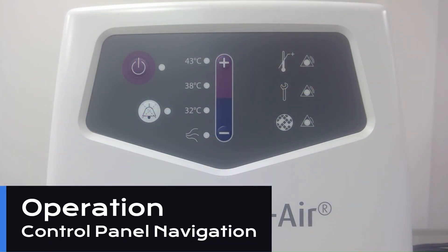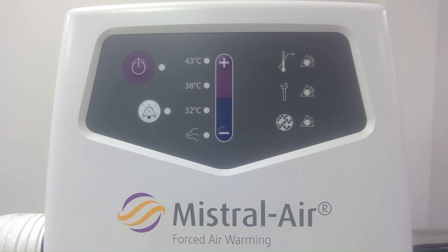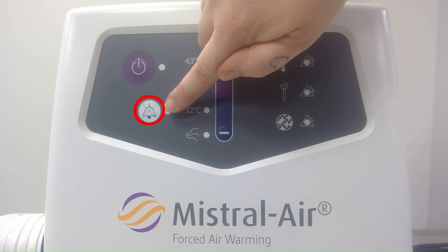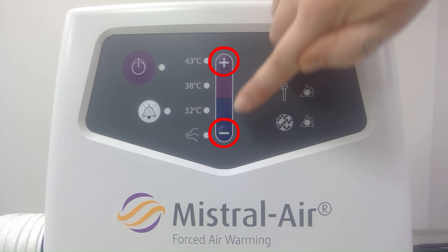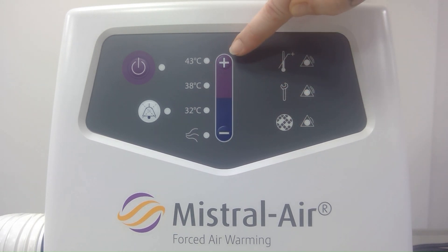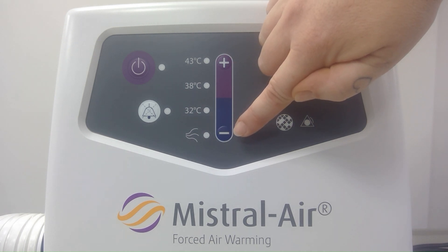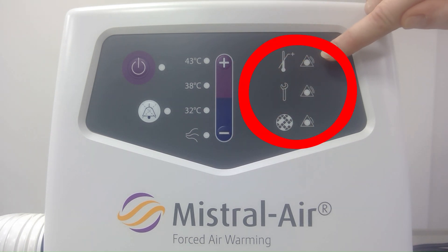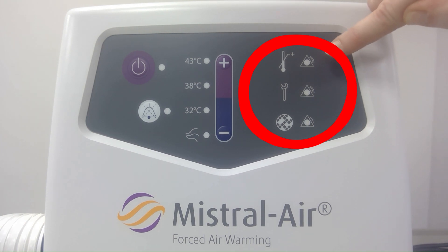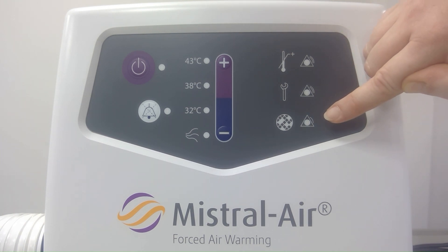To operate your Maestral Air unit we can use this control panel. We have a power button to turn on and off the unit, a button to pause or silence alarms if they are triggered, and the plus and minus buttons which we can use to adjust the temperature range or enter an ambient air mode. We also have three symbols and LED lights which alert us to any alarms that are triggered if any issues with the unit occur.